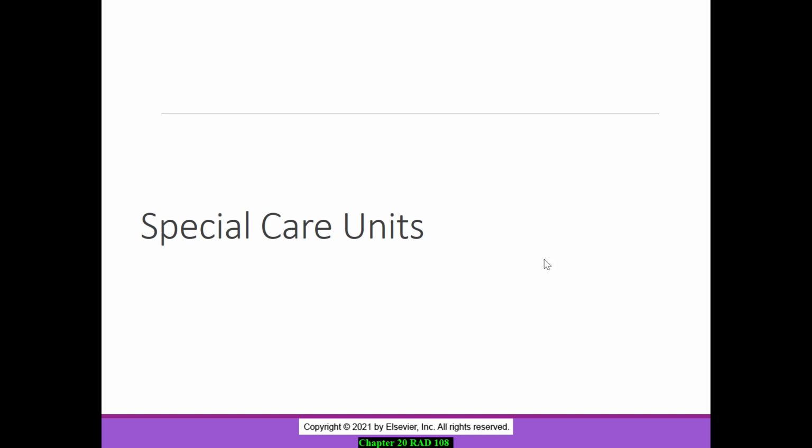So you're doing some bedside radiography and you're taking a look at that room. What do you need to be aware of, and how are you going to maneuver around that device to obtain those two views that you need to get? And take a look at the size of the room. Are you going to be able to obtain a 72-inch SID when you go into that room, or maybe you're only going to be able to get 56 inches? So being aware of your surroundings is very important when you're going up to those patient rooms.